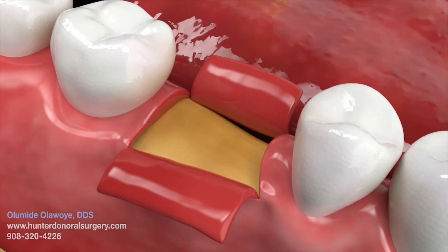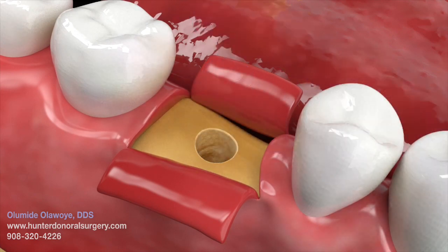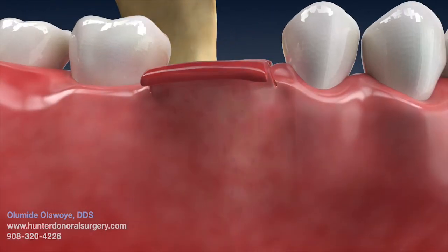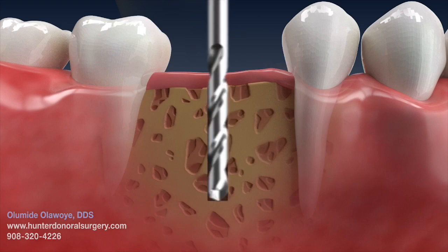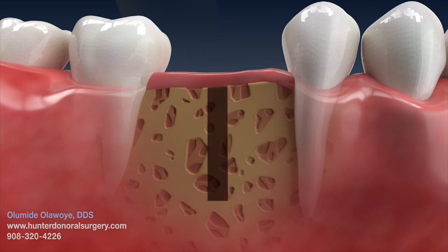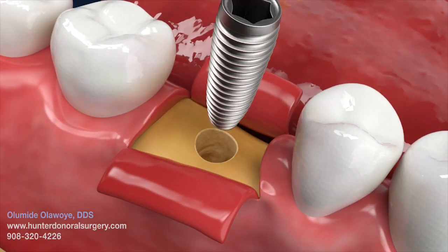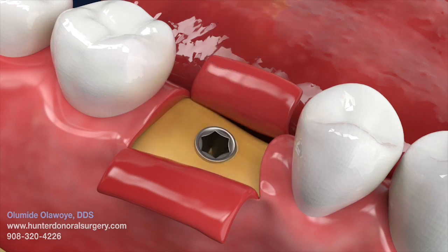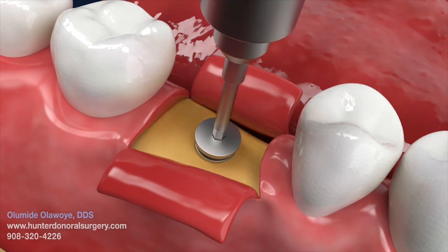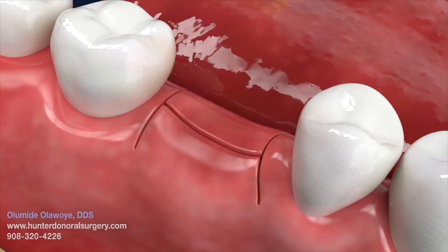The position of the implant is prepared using specialized drills on a surgical motor. The drills are used sequentially from the narrowest to the widest. The implant is then placed and a cover screw or healing collar may be screwed into the implant. If an incision was made, this is then closed with sutures.